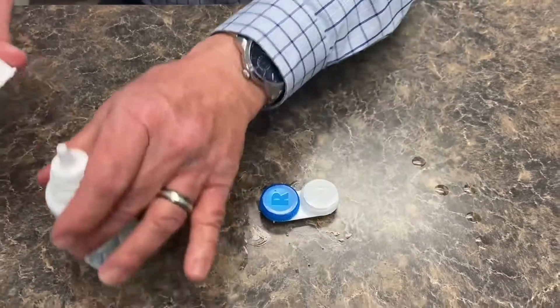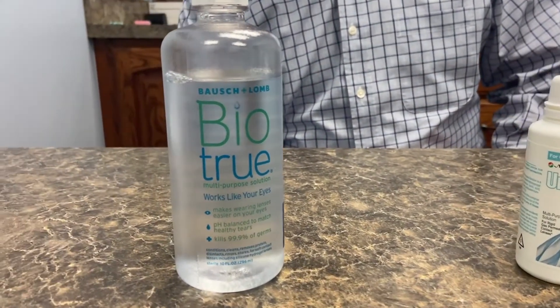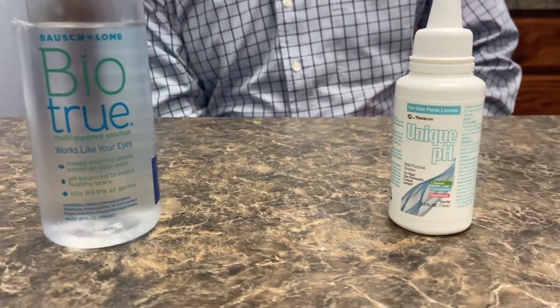Something I've taught my patients to do that really helps them be a lot more comfortable is once a week use a different solution called BioTru, made by Bausch & Lomb. It's a soft lens solution that has excellent hydrating and wetting agents in it. If they take and clean their lens using the same procedure with BioTru and store it in BioTru once a week, their lenses seem to wet better and be a lot more comfortable. If you take care of them well, they'll last you a long time and you'll see well and be comfortable for a very long time.